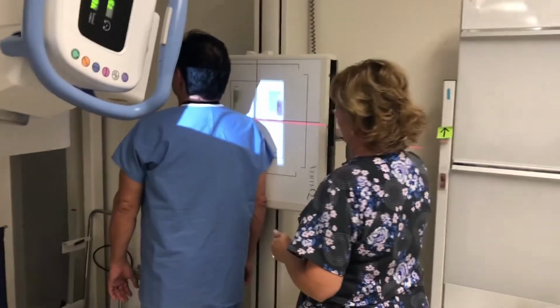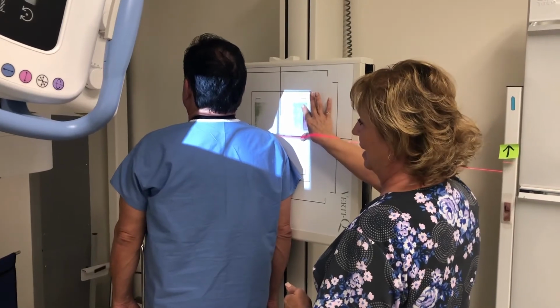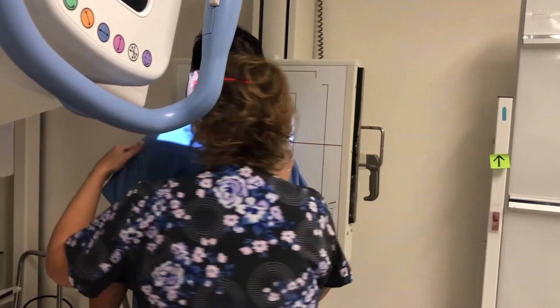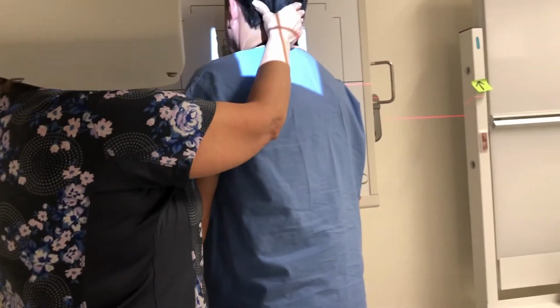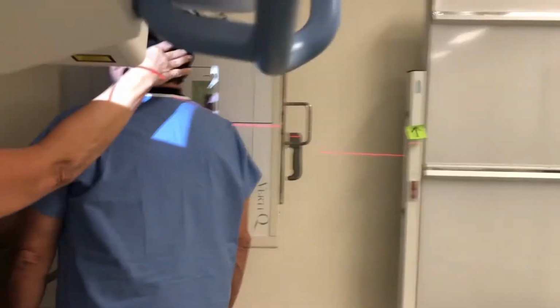So I have a 10 by 12 lengthwise in the bucky. I put my right marker because he's RAO. I'm going to position him, back up please, angling my patient 45 degrees, and his head remains lined up with his body.